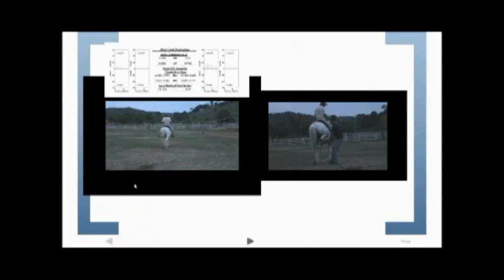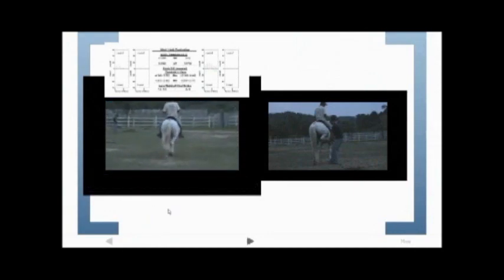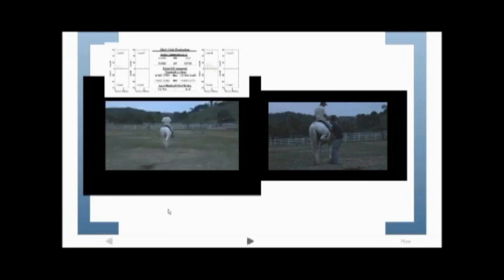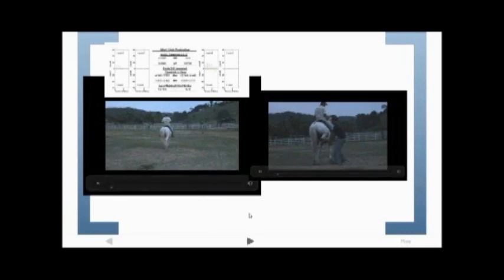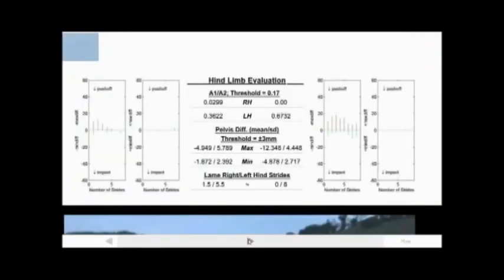Lameness Locator can also be used to evaluate flexion tests, but a baseline before flexion trial that collects and analyzes approximately the same number of strides as evaluated after a flexion test should be collected first for comparison. Baseline before flexion is a selectable trial option in the Lameness Locator software. Then you look at the results in the dual report.